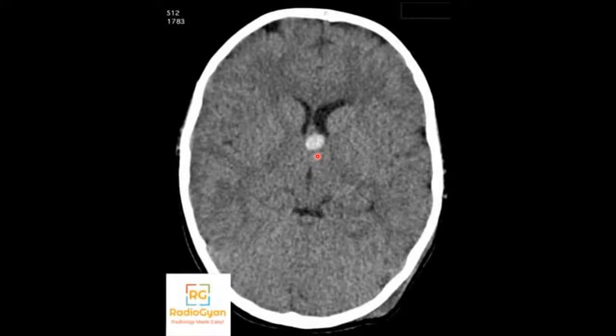So Ramit, we should mention that there is no hydrocephalus. If you see a colloid cyst, you should mention that there is, okay.